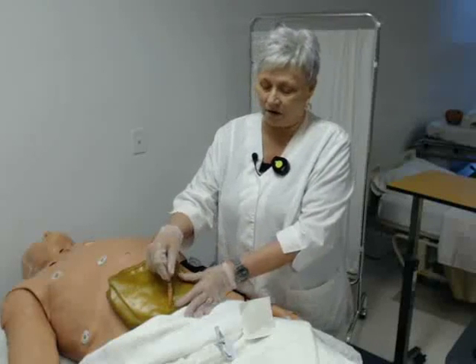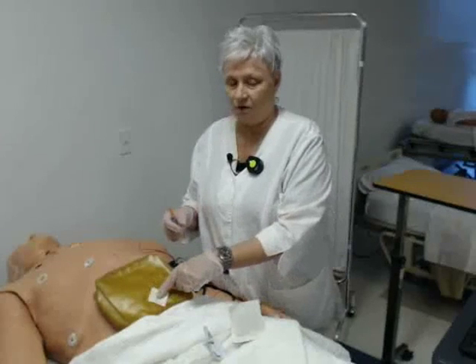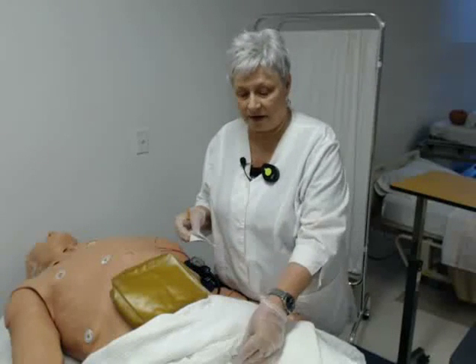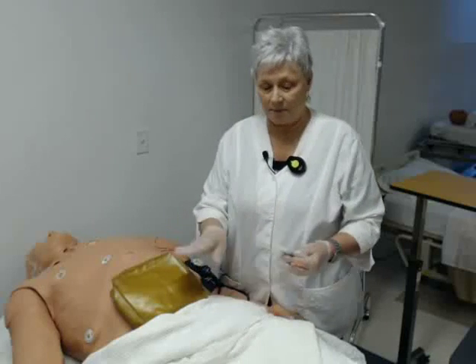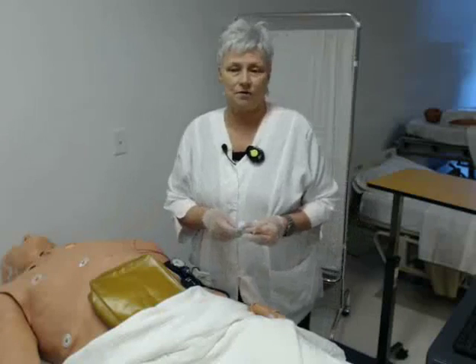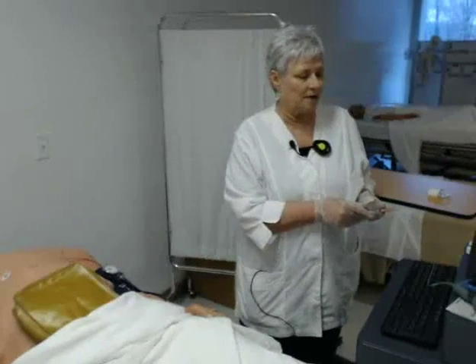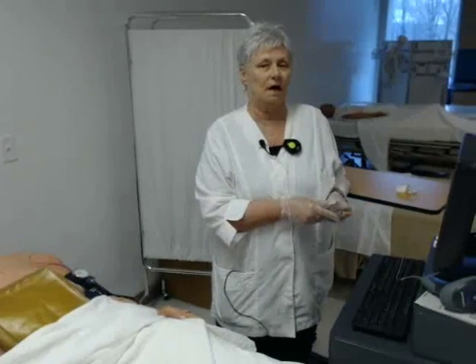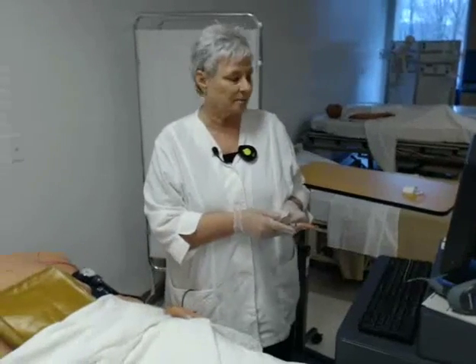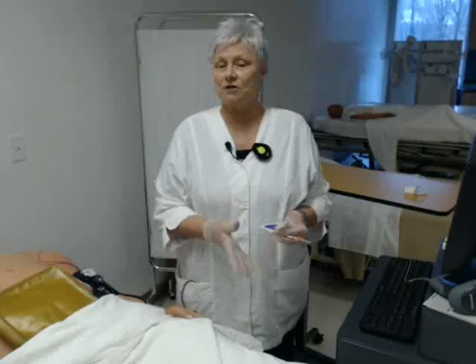You notice I did not aspirate. So I will come out and then engage my safety device on my needle right away, and use my 2x2 for a little pressure. Again, not massaging. We'll make sure that there's no oozing or bleeding before we leave and situate our patient. Make sure he's comfortable, put our rails up, lower the bed and all of those good things. Then we can go to our computer, or your paper MAR whatever system you're working in, and you might need to indicate the site that you used. We could have checked the site from before to see where it was given, just to be sure we give it in a clear spot. And then we have recorded our medication — we have electronically signed it already by scanning it. And that concludes our demonstration of a subcutaneous injection.